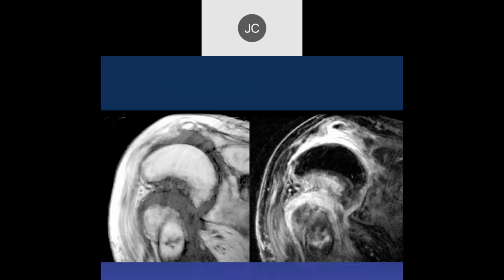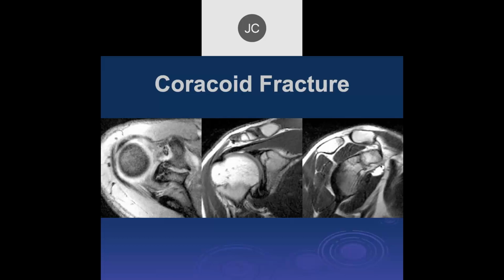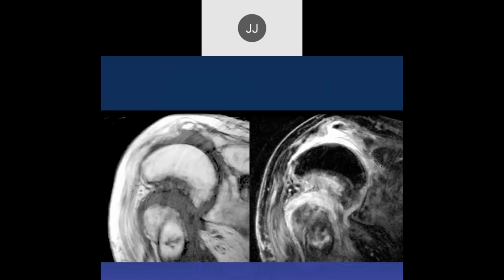Okay, so that's here. The conjoint tendons attach in that vicinity. I wonder if it's a pulled fracture. You don't see too much edema there, John, do you? No, not too much at this point, right?